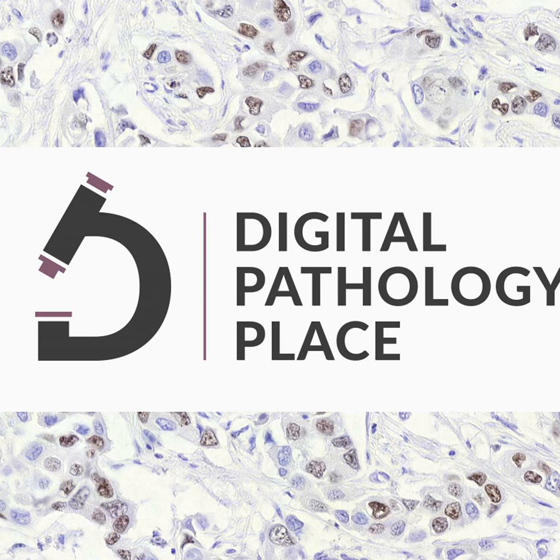So it is important to ask yourself, okay, do I need this? All these delineated giraffes, this is called instance segmentation, and it's let's call it the most fancy way of delineating on an image. And our brain gravitates to, we would like to have that. Do you really need to have that? Maybe you can just have the boxes, or in this case, maybe you can just have the pixels, which is also valid, right? And if it correlates and if it brings you the same information.